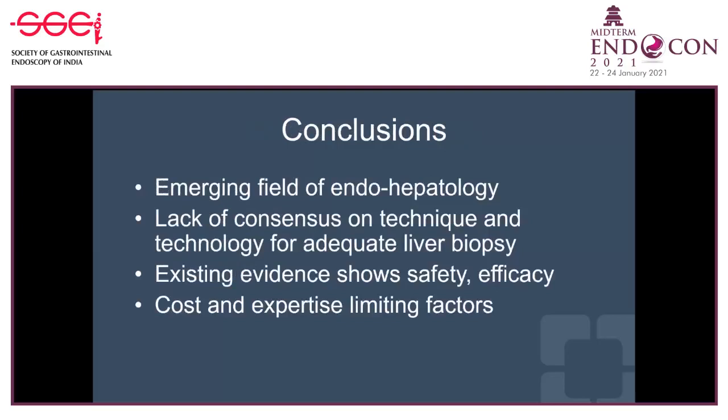So in conclusion, ladies and gentlemen, we are in an era of emerging field of endohepatology. It's imperative that we recognize, understand the anatomy of the liver in detail to maximize our chances of performing these procedures safely and effectively. There is lack of consensus on technique and technology for adequate liver biopsy. However, the existing evidence shows, regardless of the technique and technology, EUS guided liver biopsy is safe and effective.